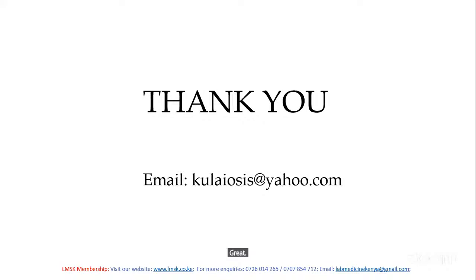Great. Thank you very much. Is actually that. And Calvin's, I hope you've taken keen note of that. You run the controls first, they need to pass. If not, troubleshoot until they pass, then you run the test. So just as it has been explained, that's very, very important. That's why I've also stressed on it. Thank you very much for that, Mr. Kula.